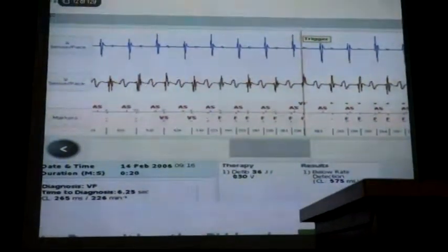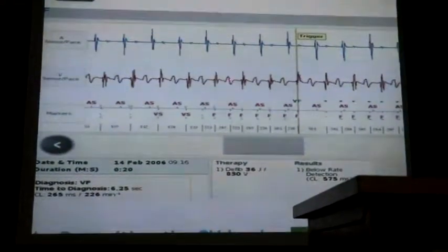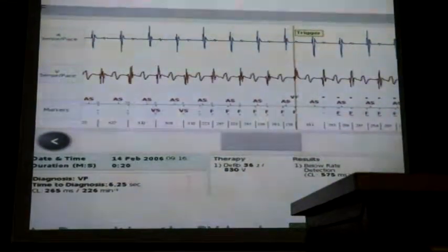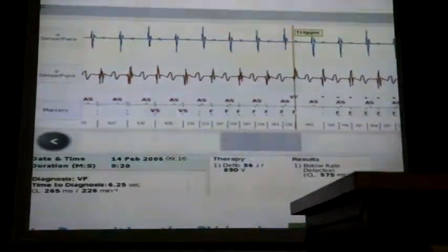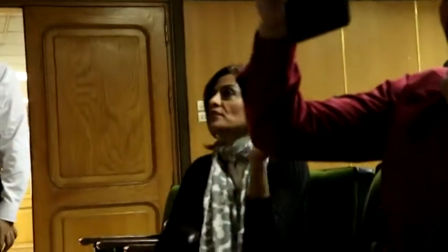Remember, contemporary devices, you are not going to see this with our new devices. We can make this disappear, okay? We don't want to see this. These are T-wave filters. Our filters have made this disappear. Because a few years ago, the problem of T-wave oversensing when you have a very small R wave was a very big, huge problem. And even when you increase the decay delay, it's still there.